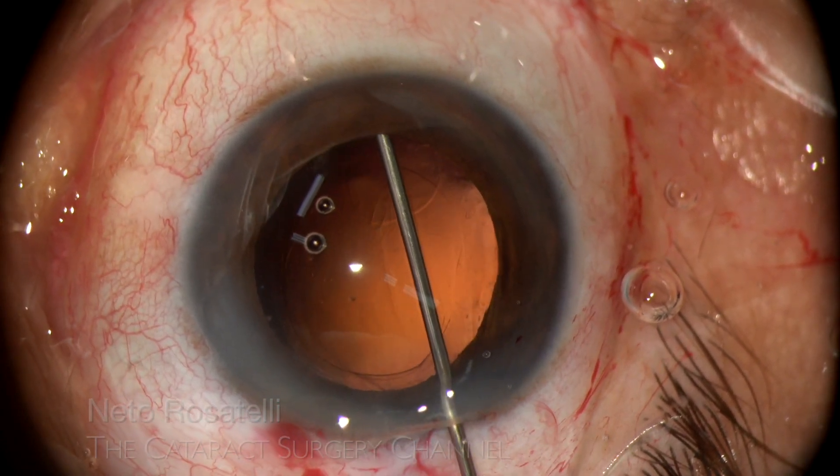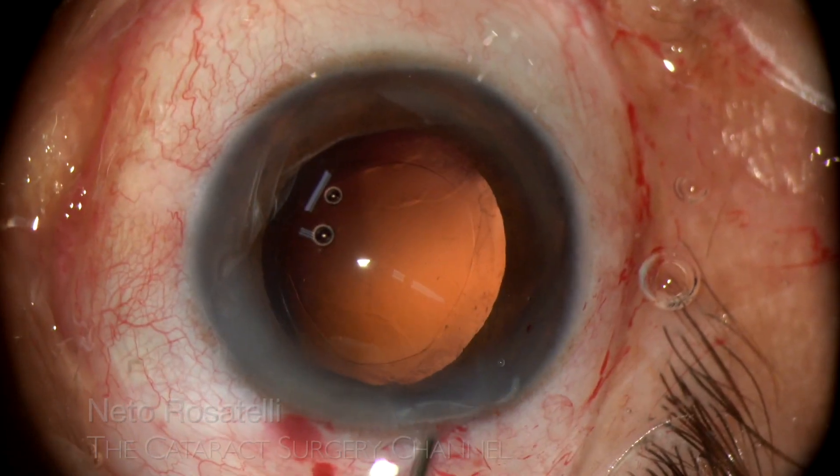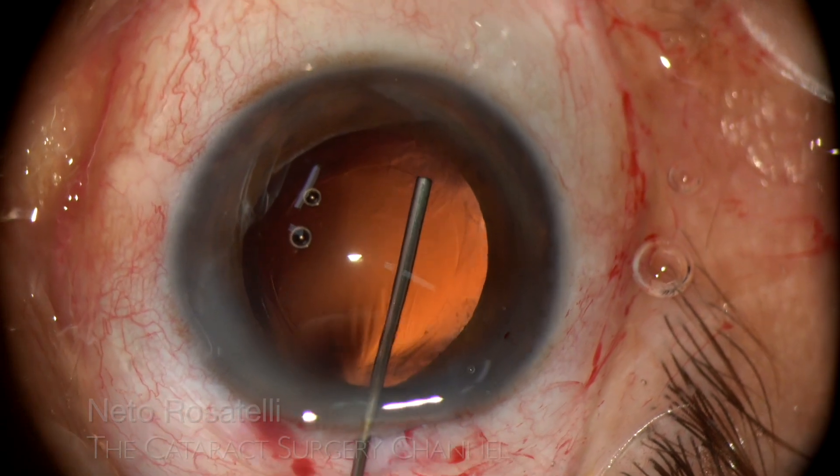Now I fill the space between the two capsule rims with OVD to facilitate the correction. This is an important step.